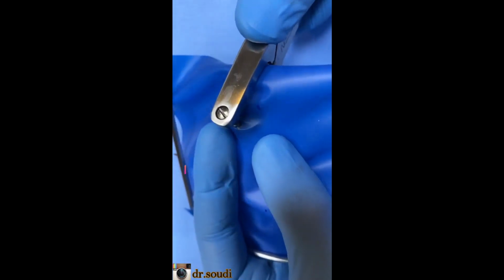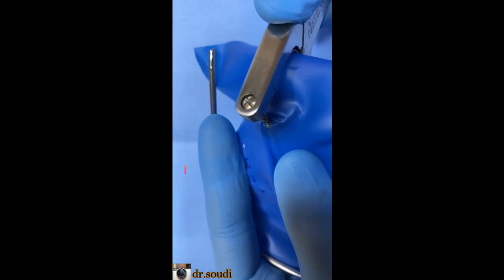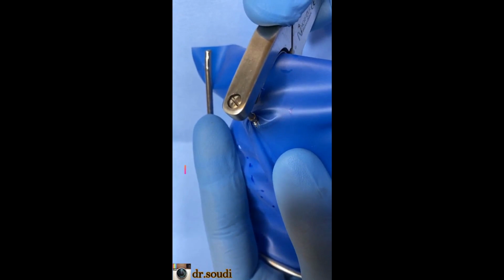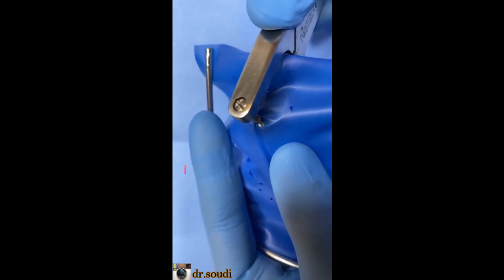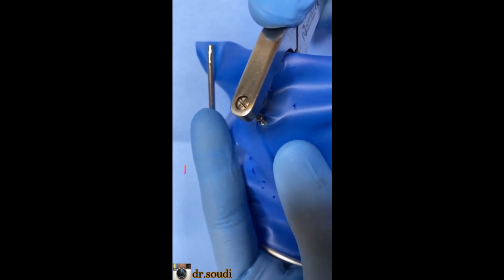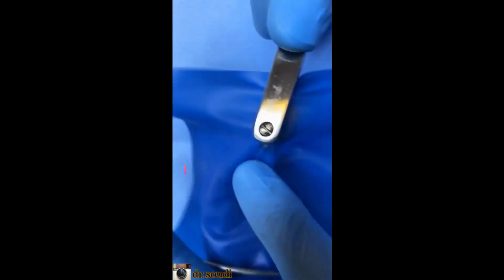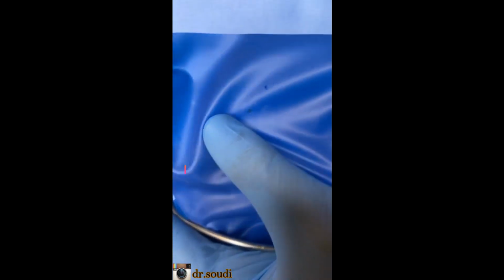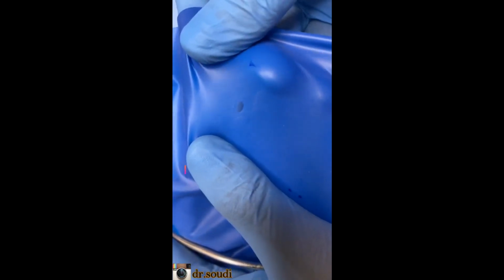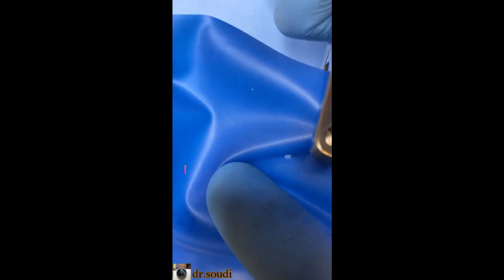If you can see this, now the hole is not completely cut. Okay, if you remove the stylus or the punch now, you will not get a uniform hole. So you need to free this one like this. You should move your sheet like this until it's all free. Remove it and you will have a uniform one. Okay, we will take another one and let you see the difference.